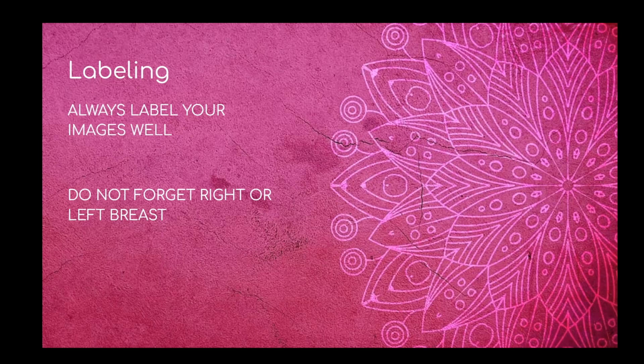So it was a little bit difficult to follow which one we were supposed to do. And then, of course, that made more work because we ended up having to biopsy both places. And unfortunately, that patient did end up having cancer. But the axilla area was actually the more worrisome looking spot. The first spot that we were going to biopsy kind of looked benign, but the axilla looked definitely cancerous. So having a good roadmap for your peers, for your coworkers to get back to the correct spot is very important.